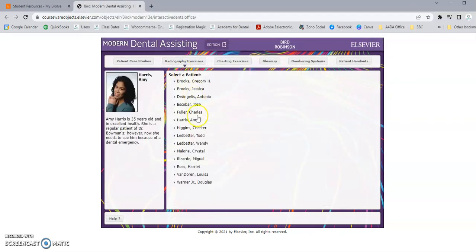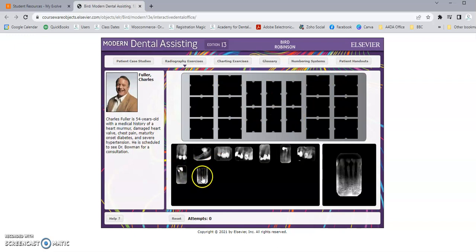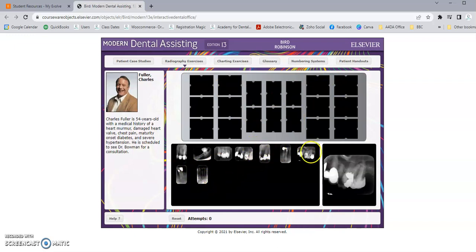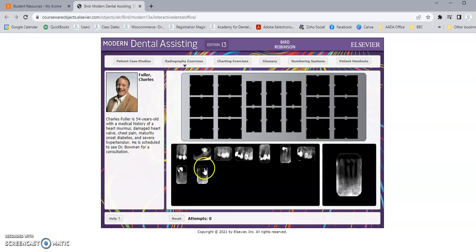Let's select another one that is an FMX. This patient does not have all of his teeth, which is why the FMX mount has this many boxes but only this many PAs, because he's missing quite a few teeth — so there wouldn't be any x-rays for those spots. To determine placement, we look at the x-ray. If you click on it, it'll come up in a box. I can tell the smile line is down at the bottom. Looking at another one, I can tell it's anterior teeth because of the size — they look obviously smaller, so they'd be your lower anterior teeth.